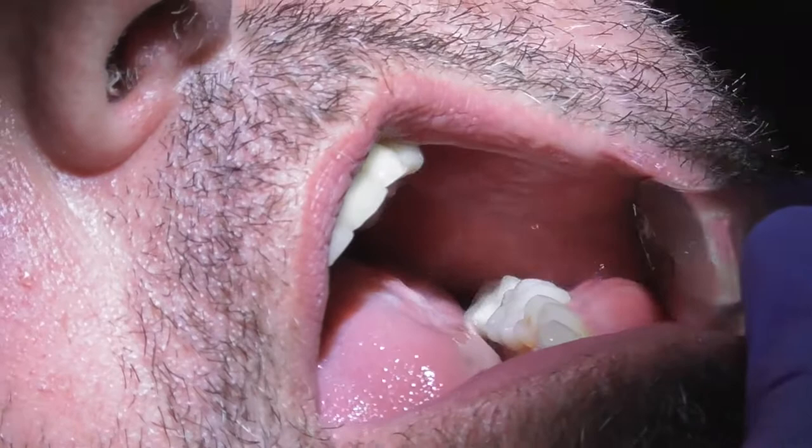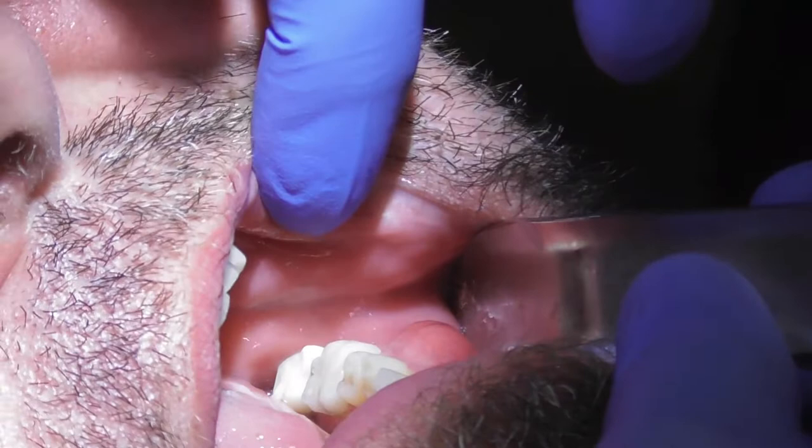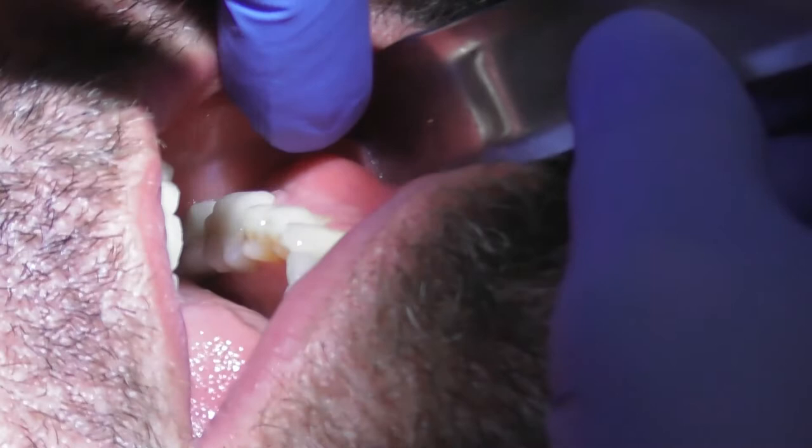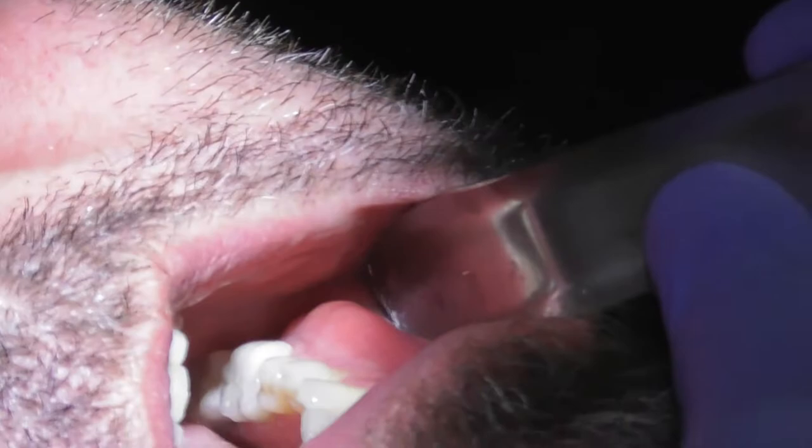What this is called is an exostosis — that's the fancy name for it. It's just dense bone. If it happens on the inside it's called a tori — same thing, different name. Very low risk. We're just going to smooth that little lump of bone down, so to do that I just gently push the gum tissues off to the side. Let's start by making sure it's good and numb.